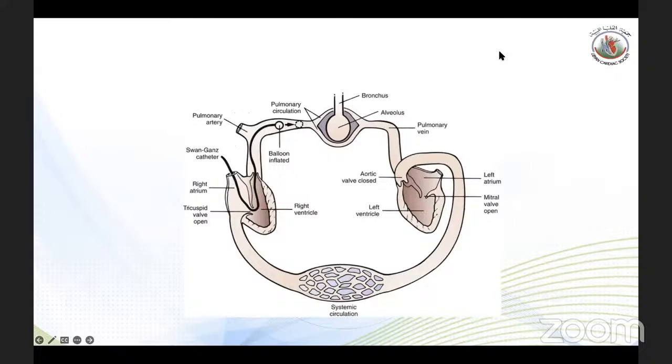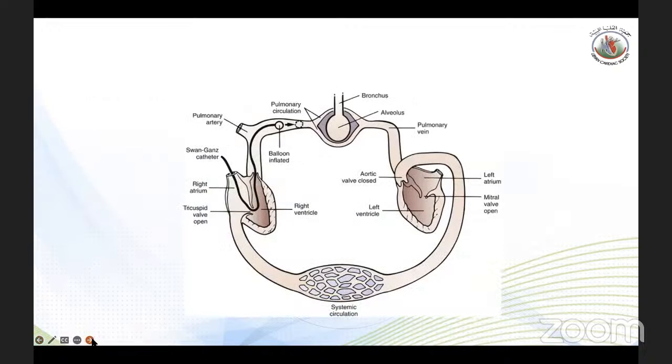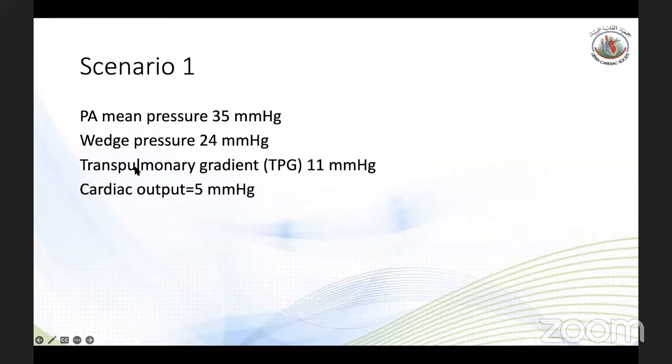I think this is the topic that was very, very complicated for me for the Royal College exam. And the question about this waveform of the CVP and the wedge, that was my Royal College exam question on the written. It's an important question, more so for the surgery group.